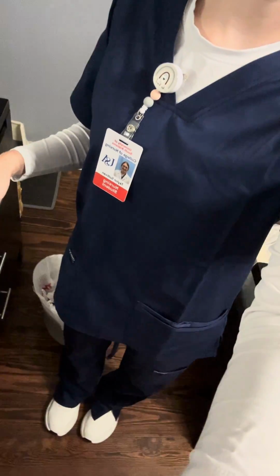...is Taylor Sullivan. During this video, I will be doing a medication administration checkoff. So I can start by showing my outfit. I've got my uniform on, I have my badge, I can do a 360. I have a trash can right there, and then I have all my equipment that I need.